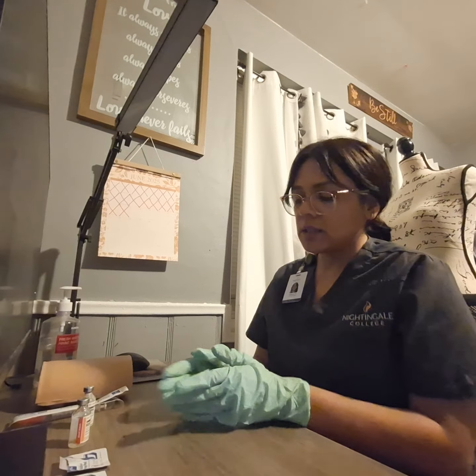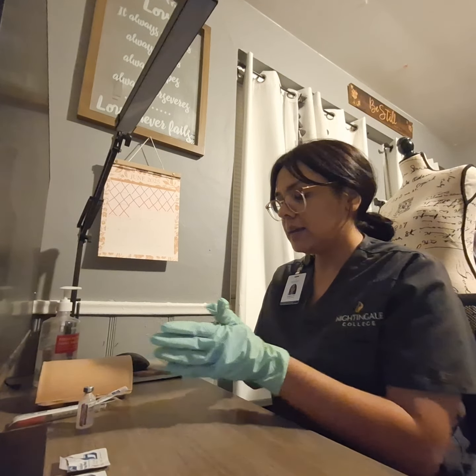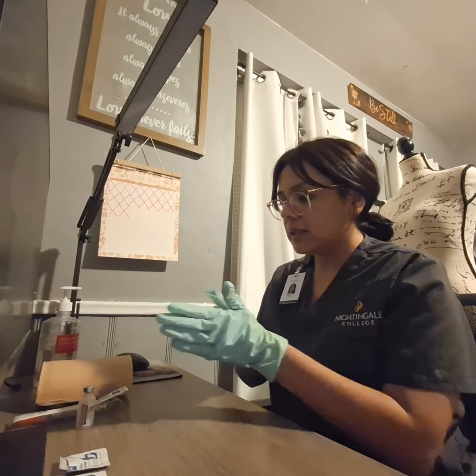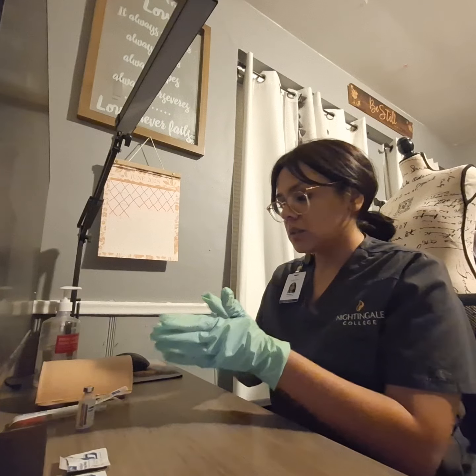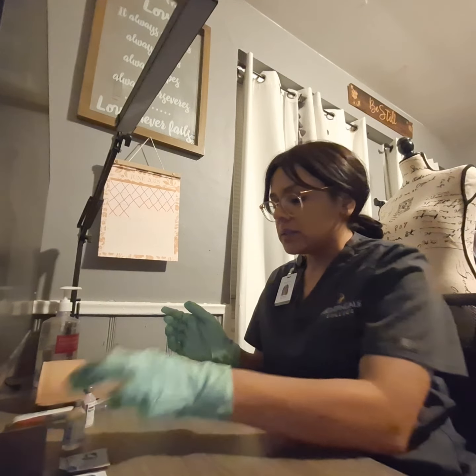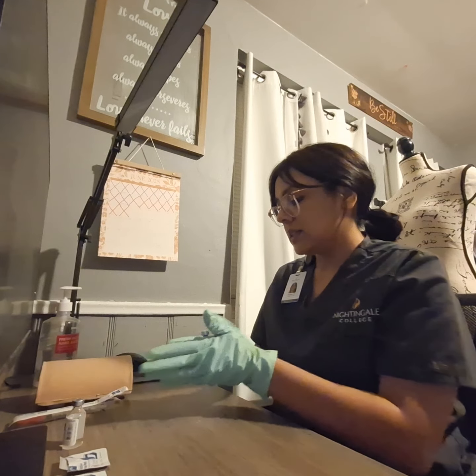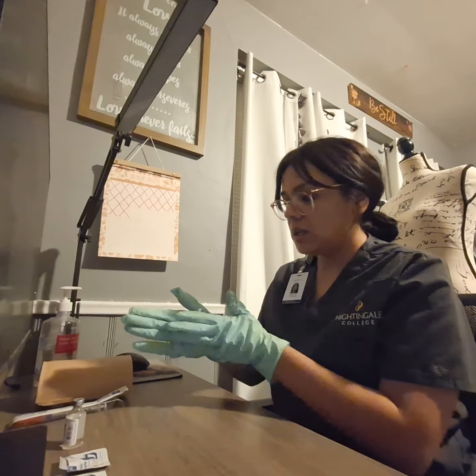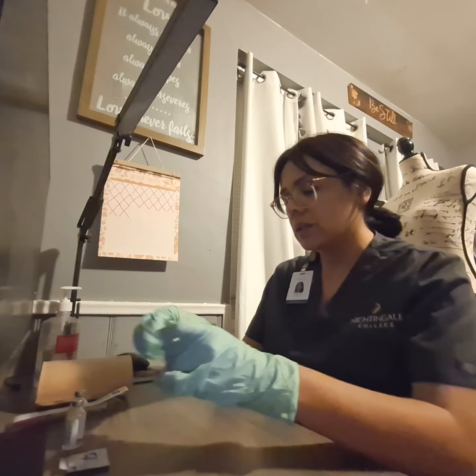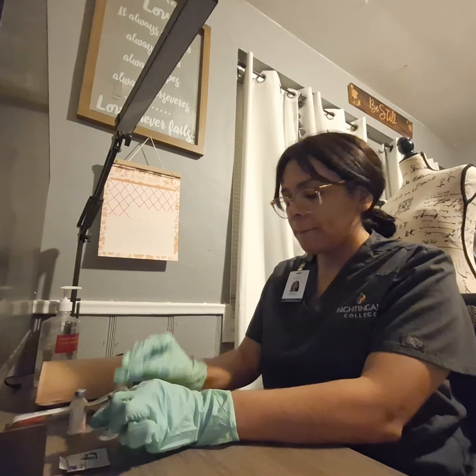And then the next step is to roll the regular insulin vials in between my hands to suspend the insulin and to warm the liquid to room temperature. So it's room temperature when we administer it and it's not cold. And I'll do the same thing to the NPH here. You'll notice that the regular insulin is clear, that's how it should be, and the NPH is cloudy, that's completely normal. The next thing I'll do is I'll clean the top of each insulin vial here with an alcohol pad.